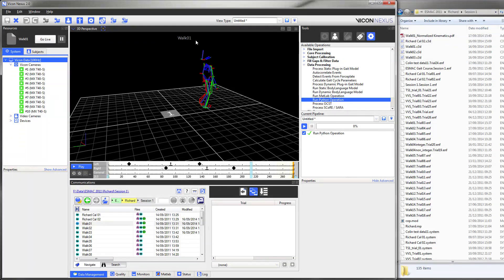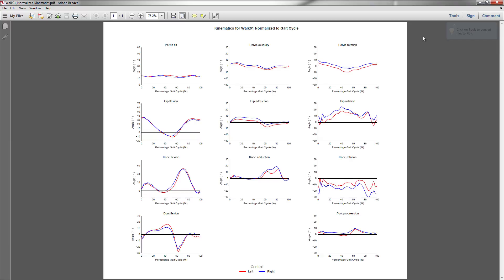There we have our PDF file, and when we open it up we get the normalized gate cycle.